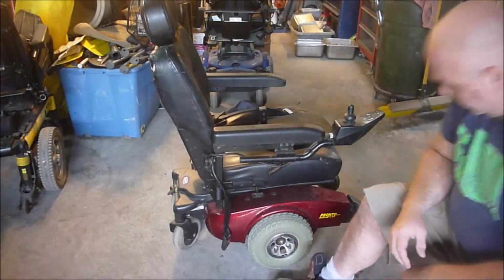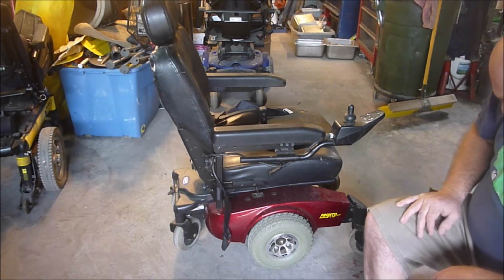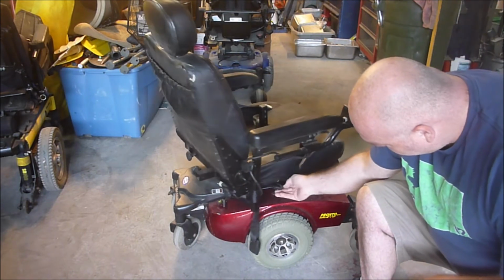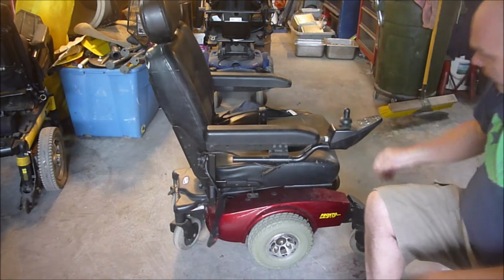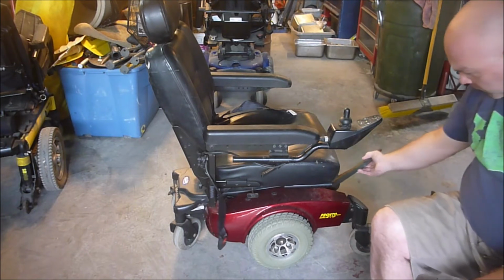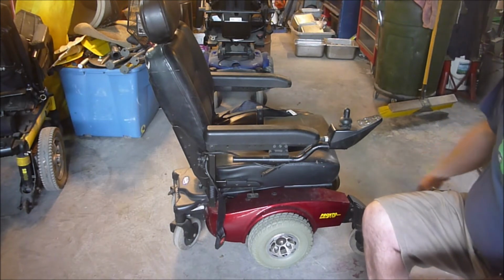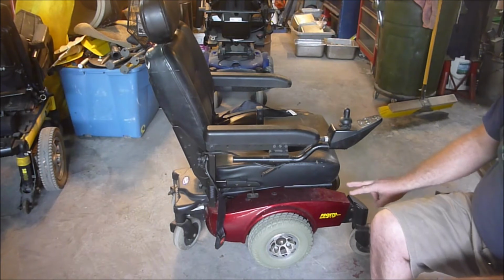Well, here's my other one. It's an Invacare Pronto Sure Step. You know, it's got the seats that go back and forth. I think it's supposed to lock somehow in there and is not locking. It came with the foot piece on here that goes in here. Got different adjustments. This one looks like it's a base model wheelchair that just comes with a couple motors and a seat. Most of these have 2 motors on them.